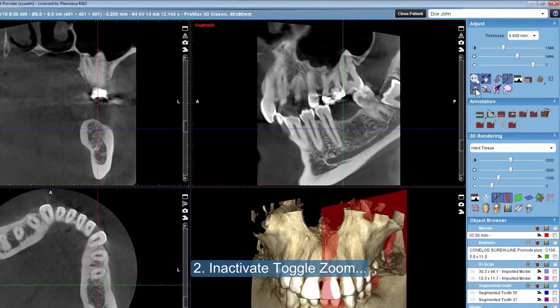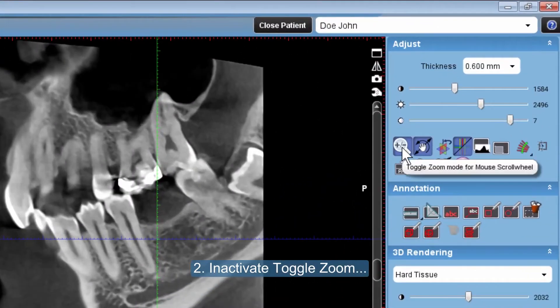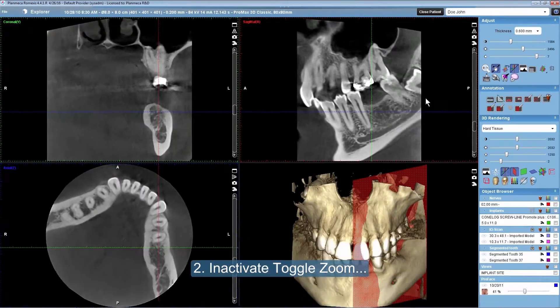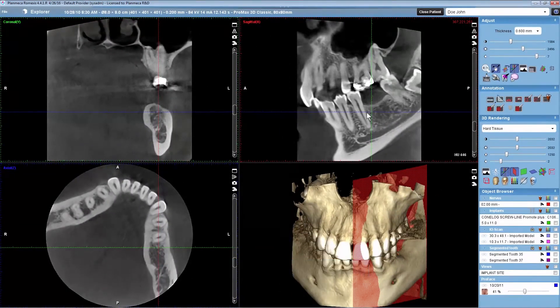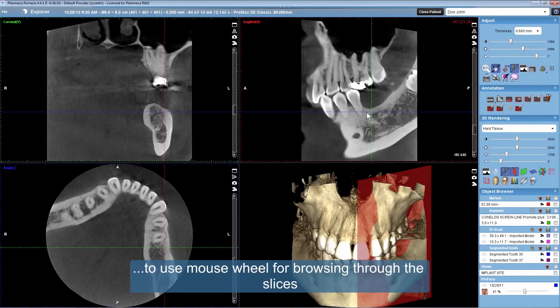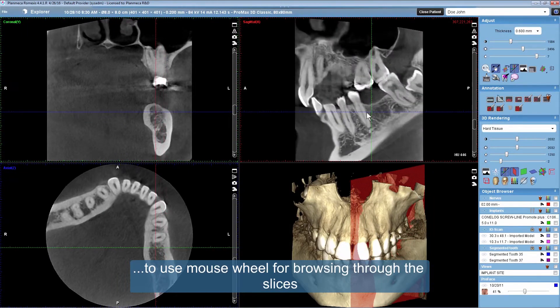Inactivate toggle zoom to use the mouse wheel for browsing through the slices.